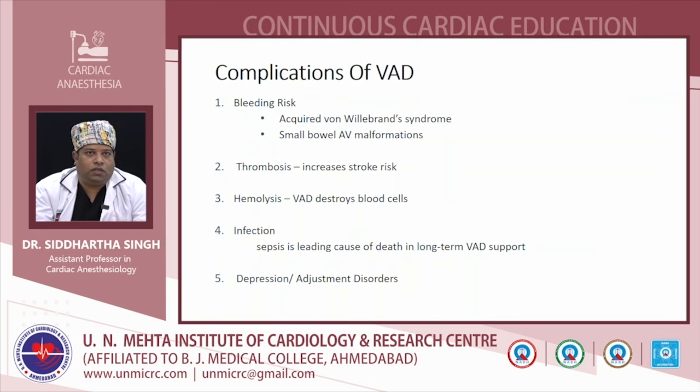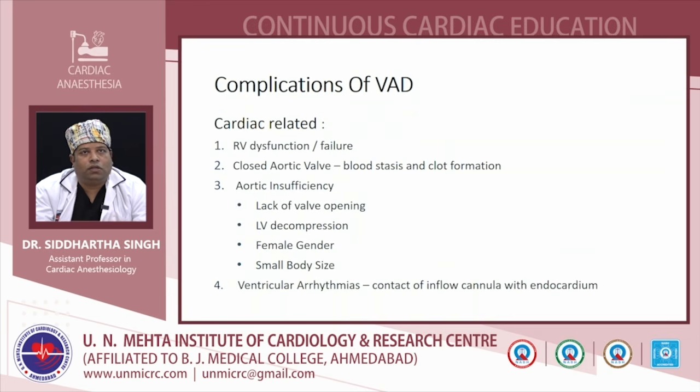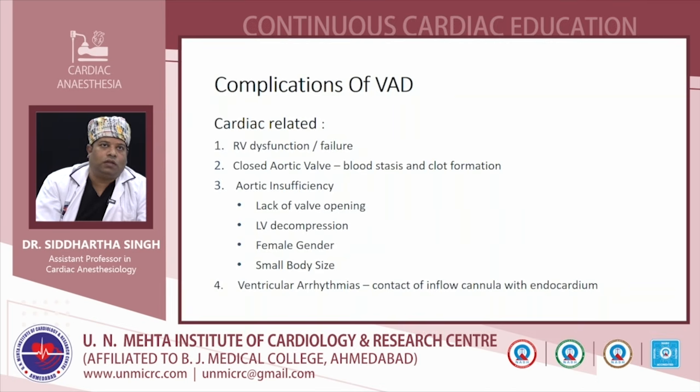Infection and sepsis: with long-term VAD use, sepsis can occur. If we are using an LVAD and not correcting the volume status and pulmonary hypertension of the patient, then there can be a chance of right ventricular dysfunction or failure, because of what is called ventricular interdependency.